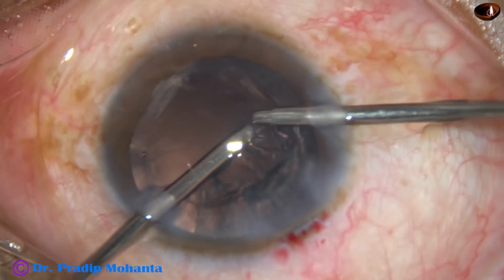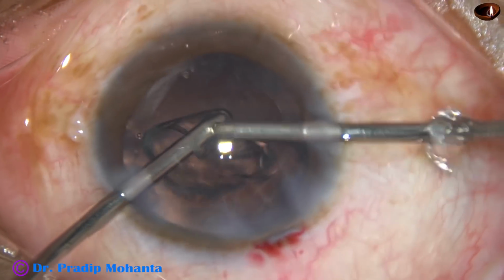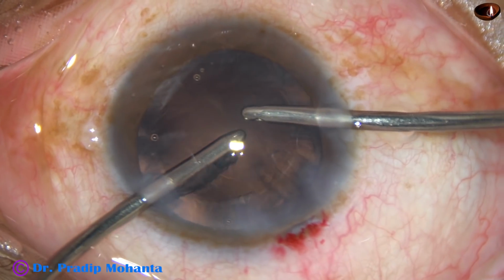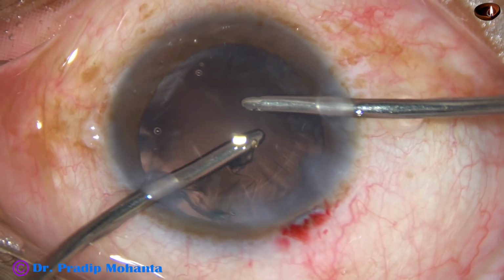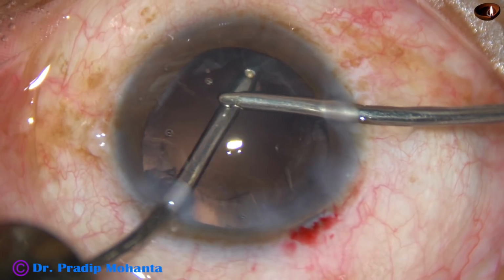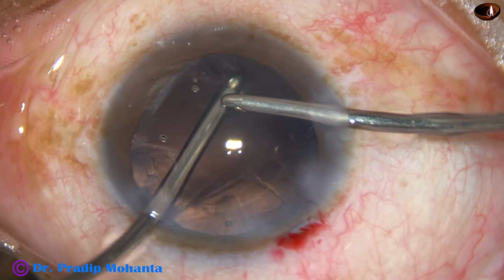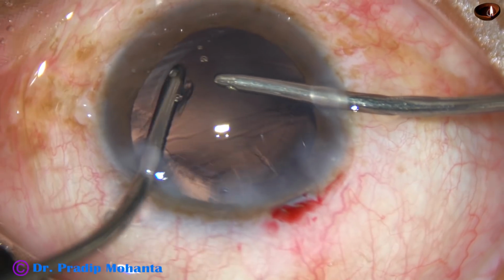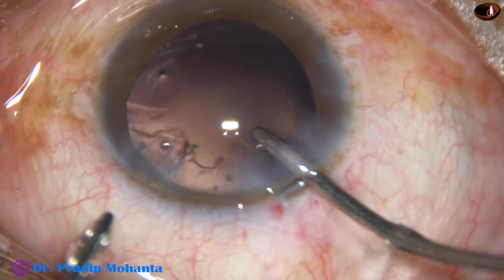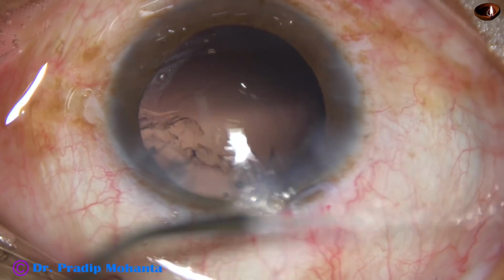And now in this case I am using bimanual irrigation aspiration for cortical cleanup. You can use Simcoe also. I also use Simcoe. I use a 23G Simcoe. But be a comprehensive cataract surgeon. Do SICS, even do ECCE in some cases. Learn phaco thoroughly. Learn Simcoe, learn bimanual IA, even coaxial IA also. Be a comprehensive cataract surgeon.